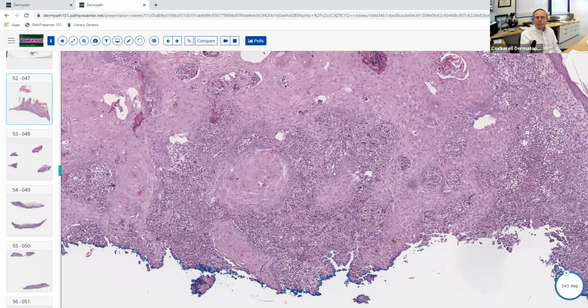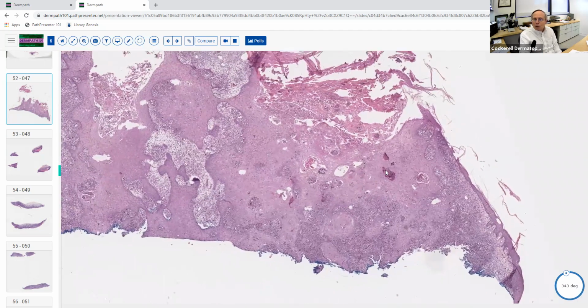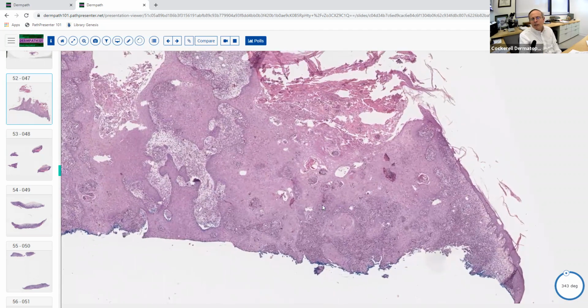And whenever you see suppurative granulomatous inflammation plus pseudoepitheliomatous hyperplasia, like you see here, your first thought, your reflex arc, needs to be infectious disease. I'm thinking this may be an infection. And it's probably going to be something like a deep fungal infection, a systemic mycotic infection, maybe atypical mycobacterial infection, something like that. So this is the classic pattern of an infectious process.